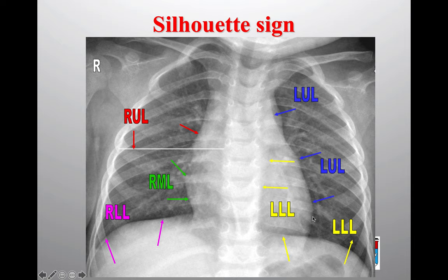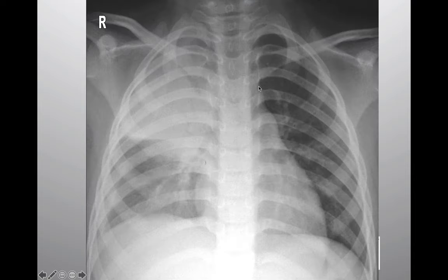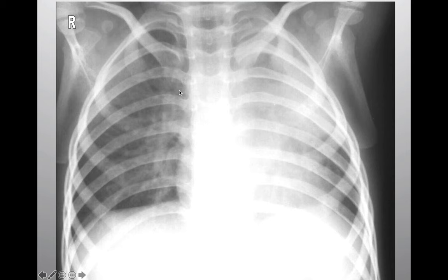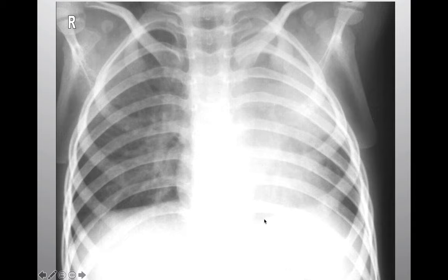The left upper lobe, being large, occupies almost the entire left mediastinal border including the left heart border. The left lower lobe has a silhouette with the left hemidiaphragm and the outline of the descending aorta. When you see opacity in the right upper lobe, it is bounded inferiorly by the transverse fissure and obliterates the upper right mediastinal border — often consolidation or bronchopneumonia, such as Staphylococcus or Streptococcus, which preferentially affect the right upper lobe.